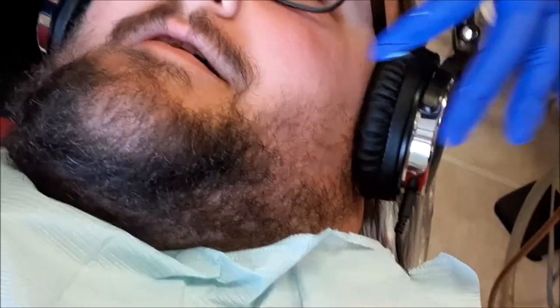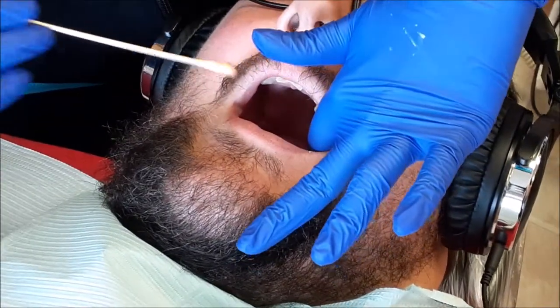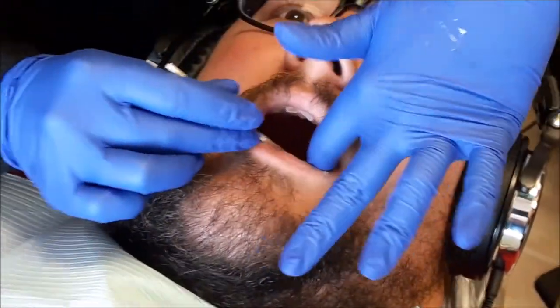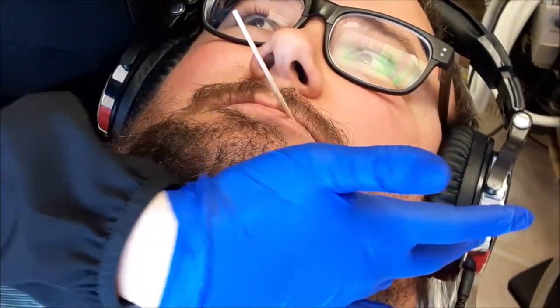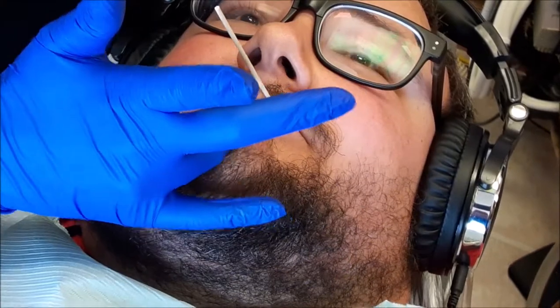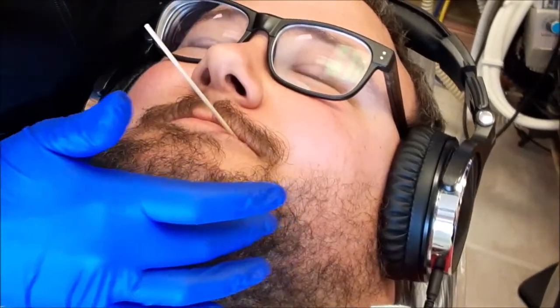We'll go ahead and just put this numbing gel in here. So I'll just have you open. We're just going to put it right back here. I'm going to go ahead and close. So this one's kind of a deeper numbing. So we're putting it back there because it's going to numb all the way kind of up to here. So hold on. Oh, all right, so it's a deeper numbing. So this one's going to kind of go all the way up to here, to your lip, about to there, and then even half of your tongue. So we just want you to be nice and numb.